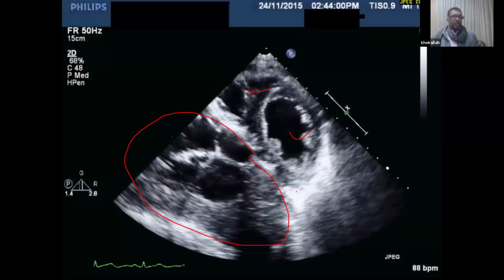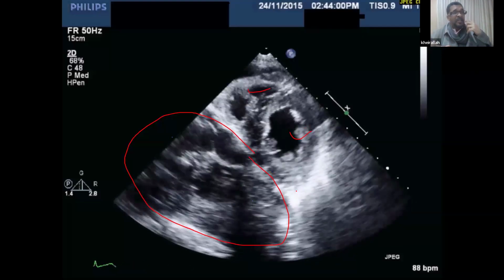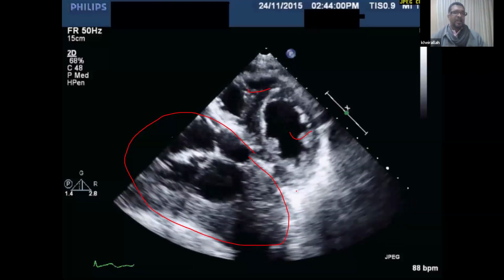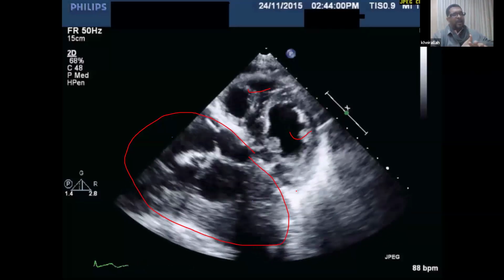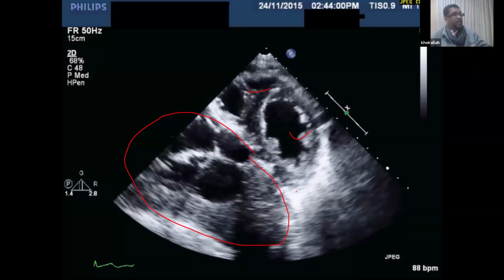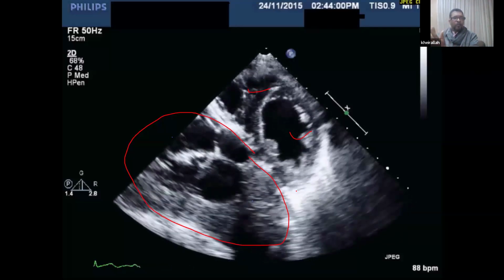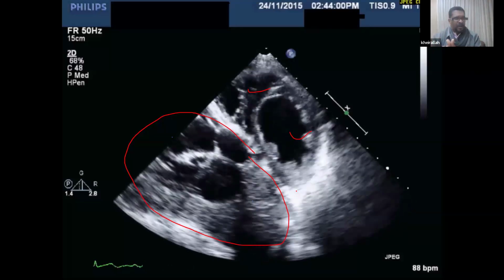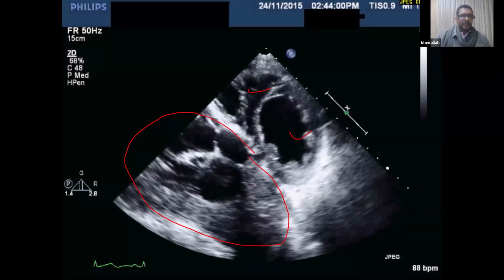Once the liver is large and polycystic, by the way, this patient has end-stage renal disease on dialysis due to polycystic kidney, but we also see the polycystic liver in echo. Sometimes a large kidney, which is polycystic, you can also see here. Remember, echo, though it has a narrow field of view, you can sometimes see extracardiac structures. So you have to familiarize yourself with stuff like this.